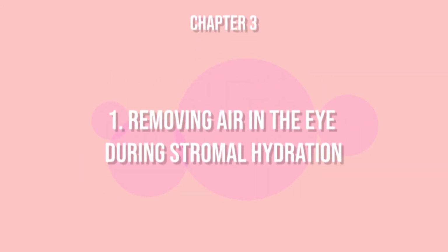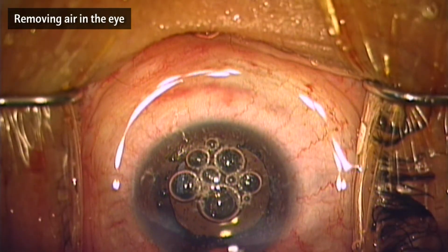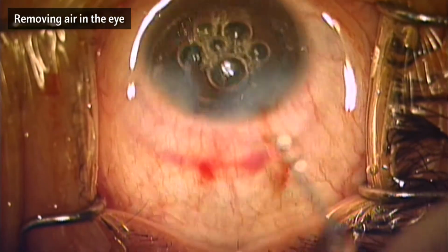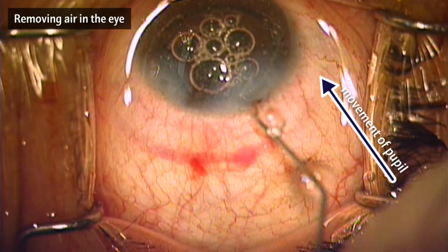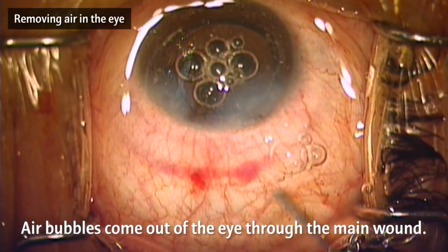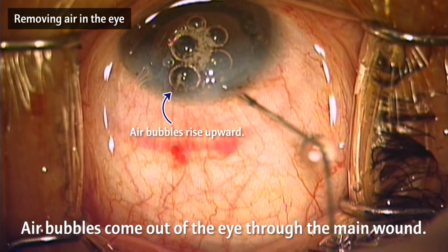In addition, let's see how to get rid of the air in the eye during stromal hydration. There are lots of air bubbles in the eye. Ask the patient to look at their nose. Then the pupil moves to the other side of the main wound and the air in the eye rises upward. This makes it easier to remove the air by injecting BSS during stromal hydration.